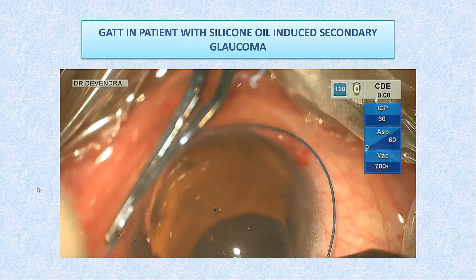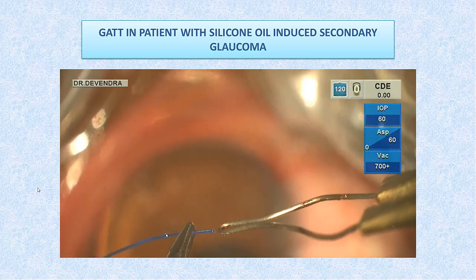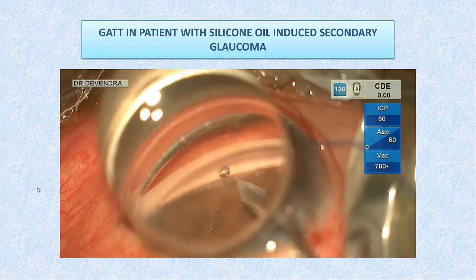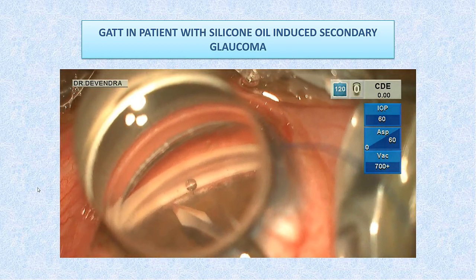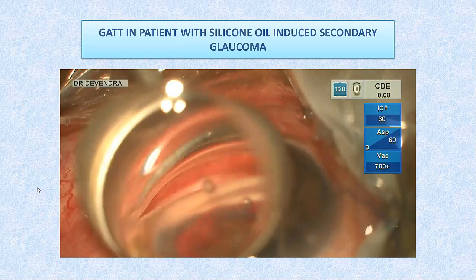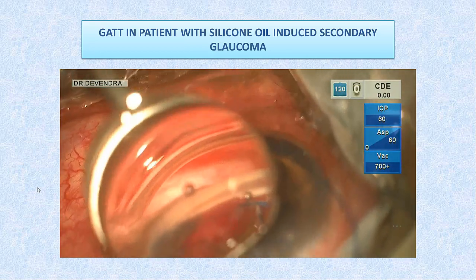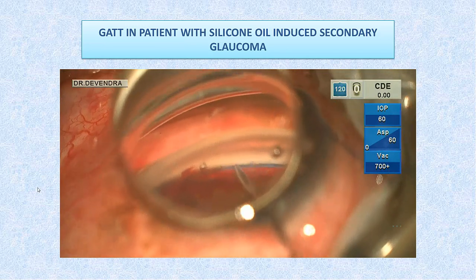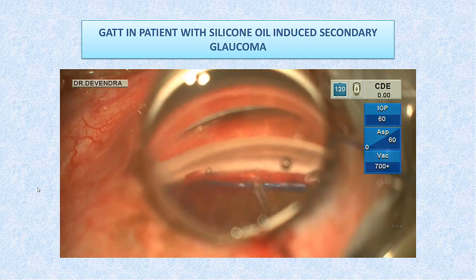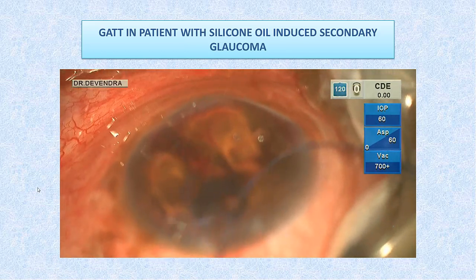Measuring the circumference of the suture required, kinking it, preparing our tip of the suture. 1 to 2 mm goniotomy. Passing the suture. Retrieving it. Leading tip grasped, and 360 degree trabeculotomy being done.